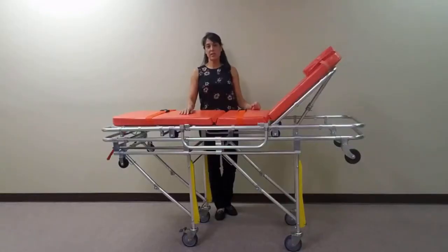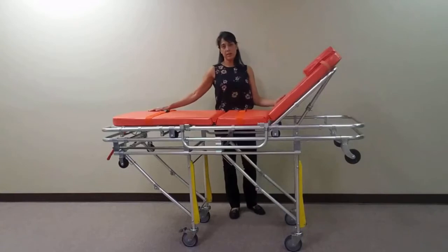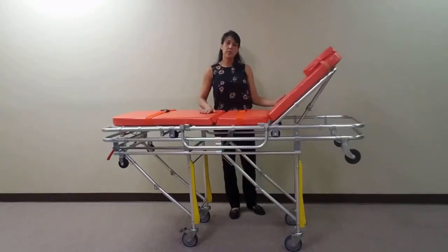The MS3C335 is designed for one-person operation when loading and unloading in a transportation vehicle. To allow for comfort in transit, this stretcher is equipped with an adjustable backrest as well as an adjustable legrest. The 2-inch fluid repellent cushion is durable and easy to clean.